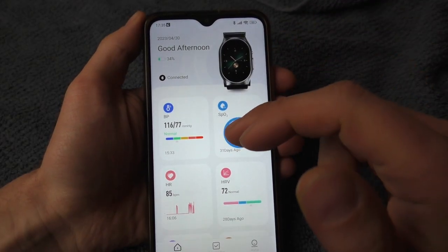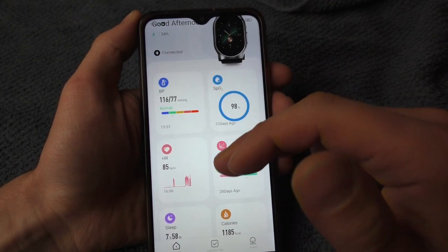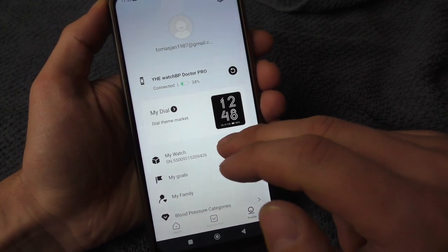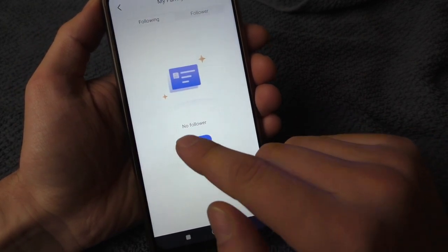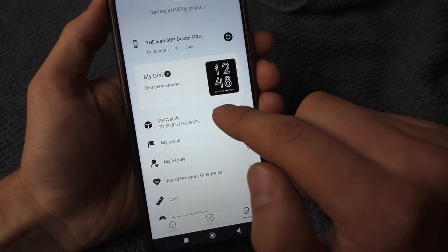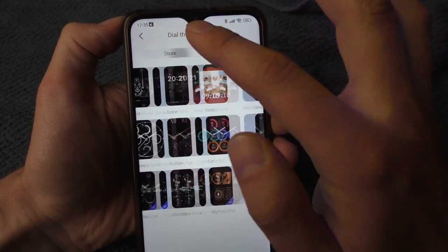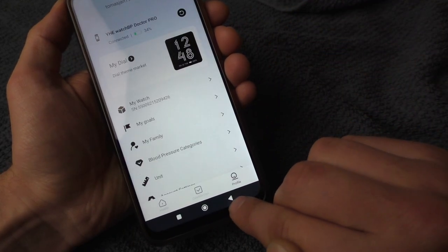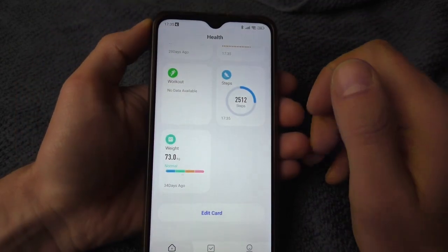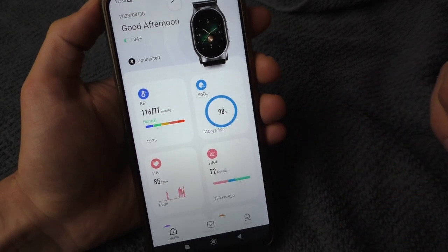The app on the phone is also very easy to use and easy to understand. You can track all kinds of statistics as usual. Also interesting, you can see how your family members are doing if any of them are wearing the same kind of device. It's also very easy to change the theme on your watch from the app, change the units, and all kinds of settings. It's simple, well laid out, and very easy to use.